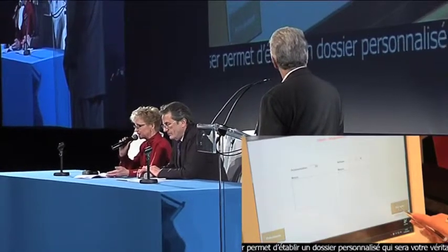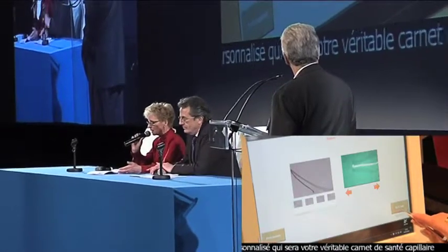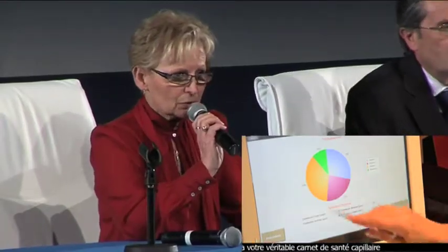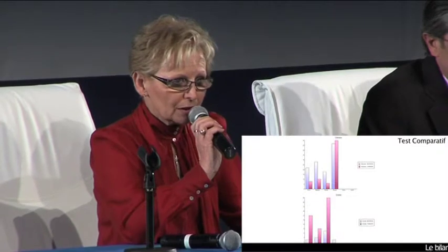So when they come to visit our institute, the important thing is that we will be able to show the clients comparisons of all the tests that they have carried out. We will have the result of the microtrichogram, but this is also for the client to be able to see on screen the results.